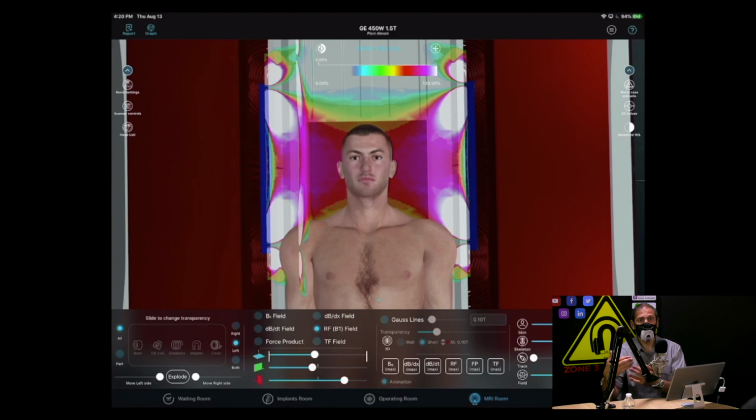It'll even go so far for other genders, heights, and weights. It may say to you, our calculations suggest your patient will not fit into this scanner tomorrow at 3. Maybe you should look for a different scanner to use. Why find that out only after they show up?